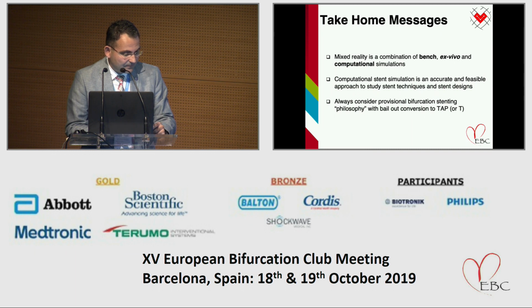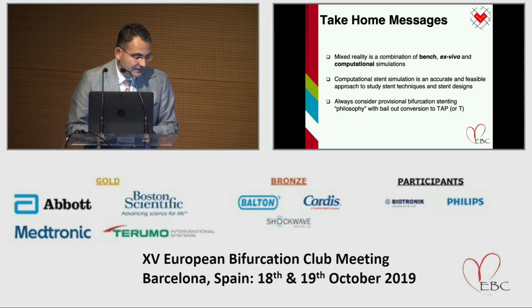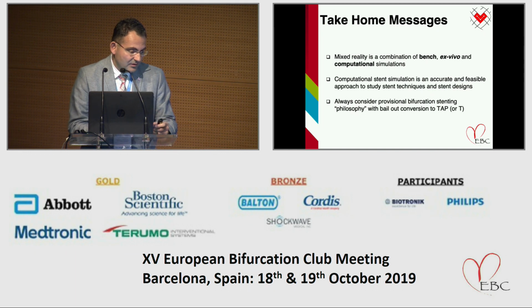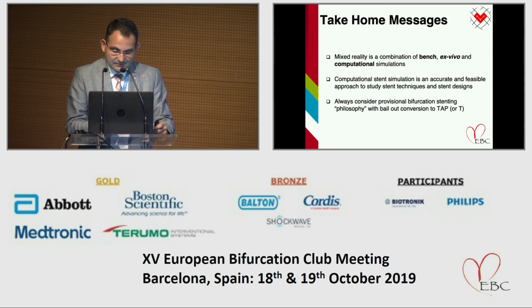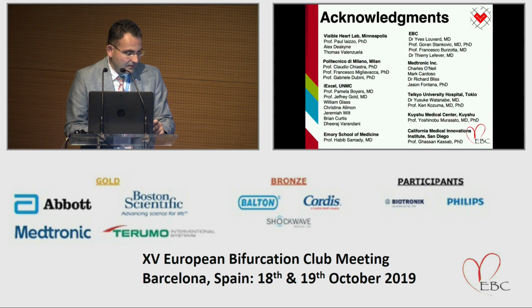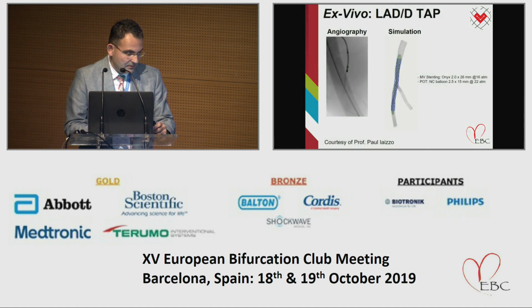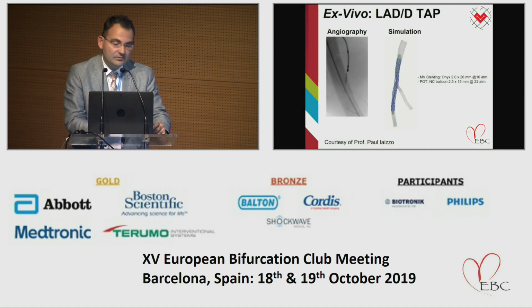And the message here is clear: we should always consider provisional, one-stent bifurcation stenting technique. That's a philosophy with bailout conversion to either T or TAP or Culotte as needed. I would like to thank my invaluable group, my engineers, doctors, biologists, multiple collaborators across the US and the world. Yes, thank you, that's the TAP.